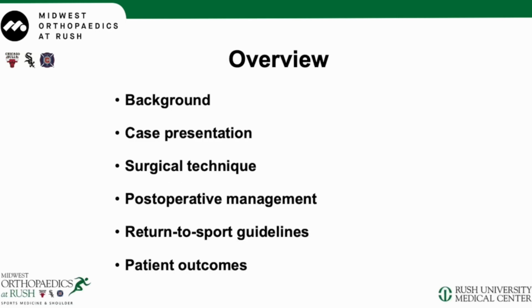In this video, we will discuss background information regarding hip labral tears, do our case presentation including our preferred surgical technique, then discuss postoperative management as well as return to sport guidelines, and conclude with published patient-reported outcomes.